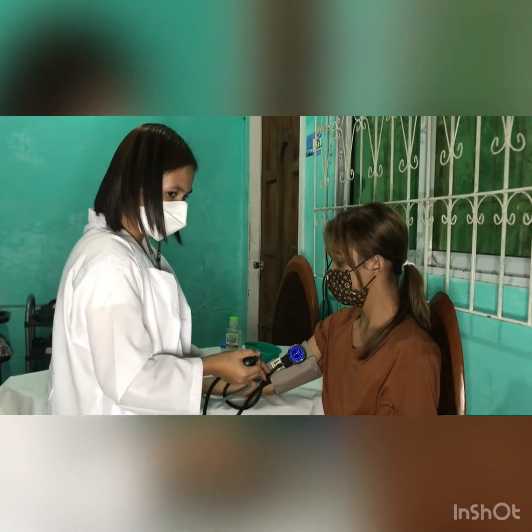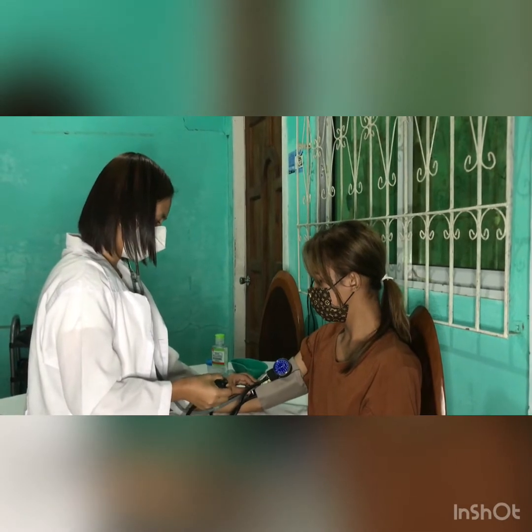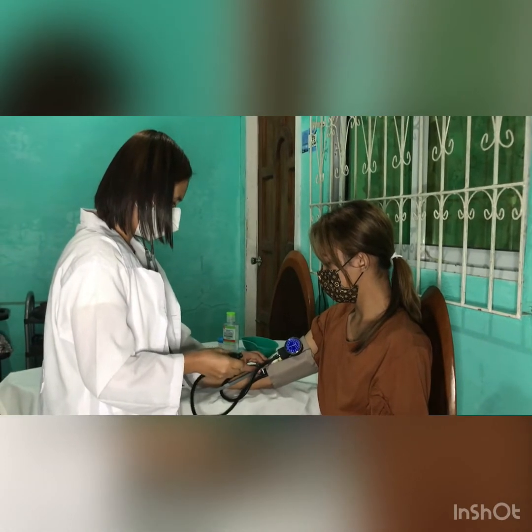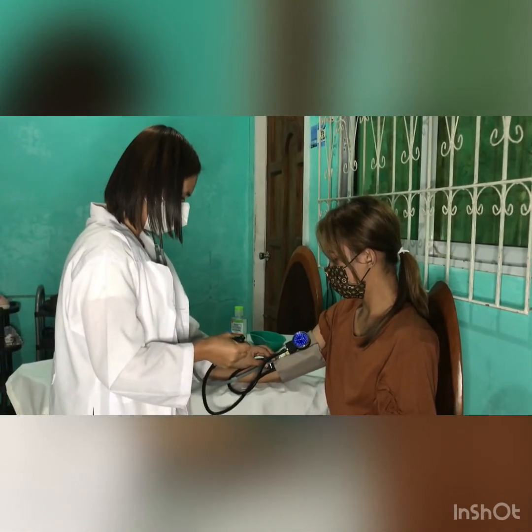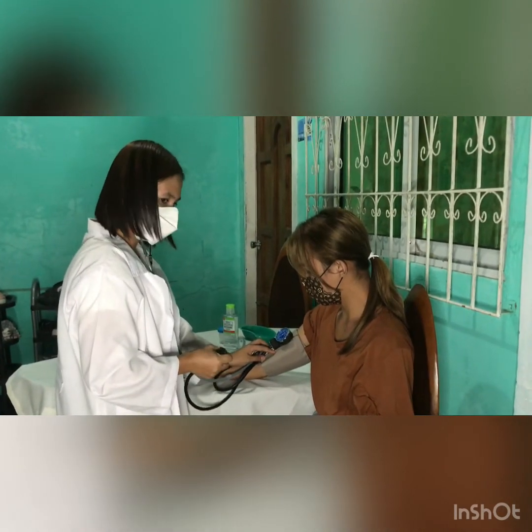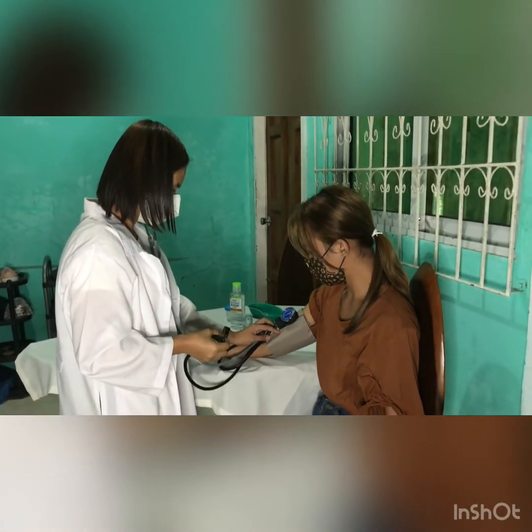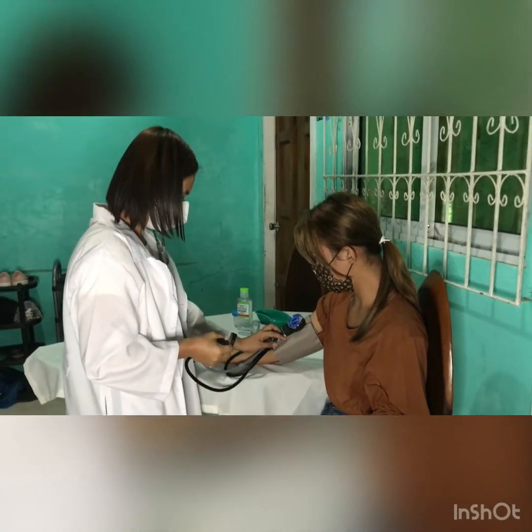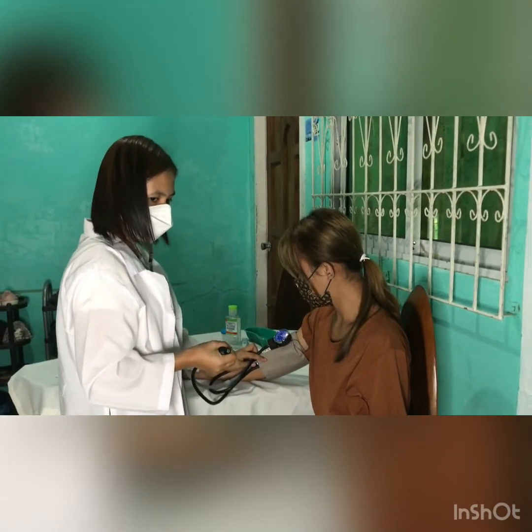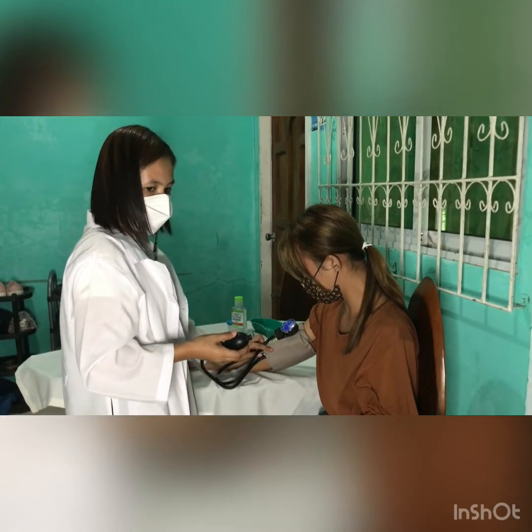Then quickly inflate the cuff until the last sound. Then slowly release, opening the pressure valve and allowing the manometer gauge to fall at a rate of 2 to 3 mmHg per second.